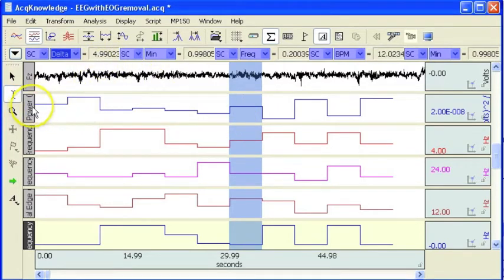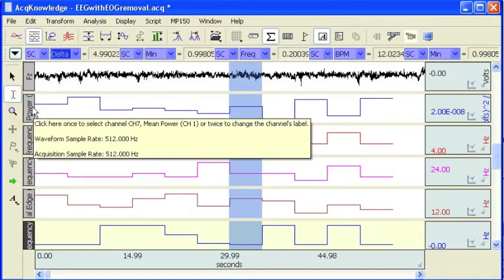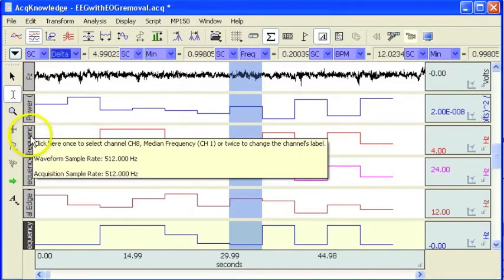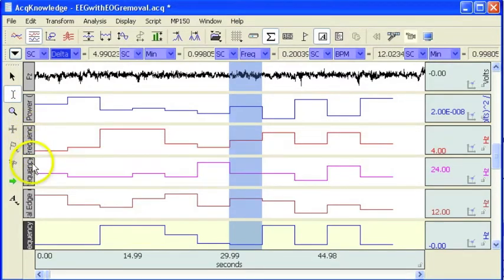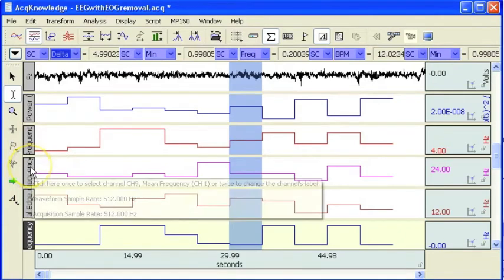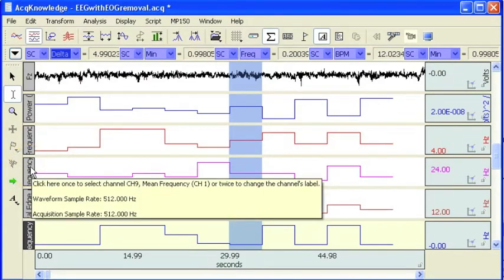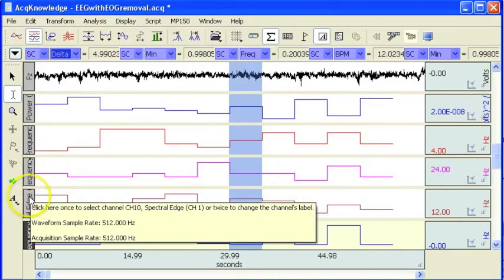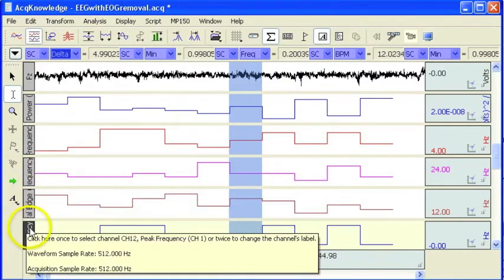This particular channel we are looking at here is the mean power. This is the median frequency, mean frequency, spectral edge, and peak frequency.